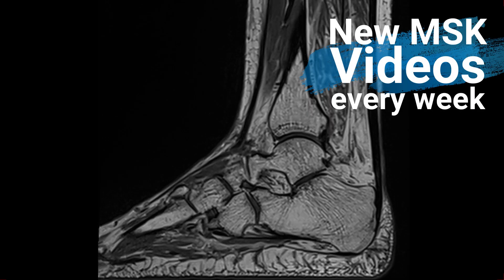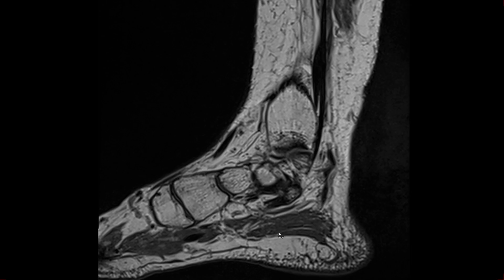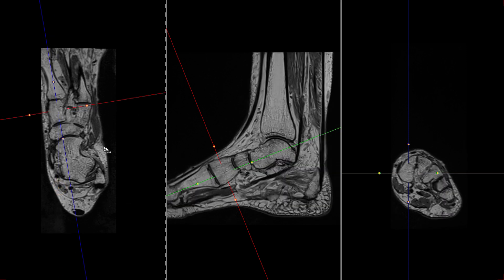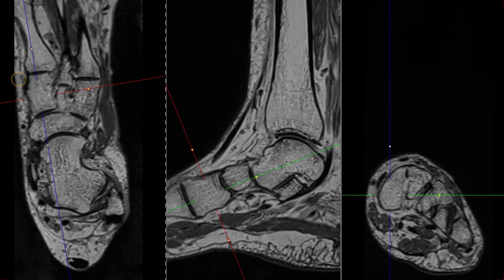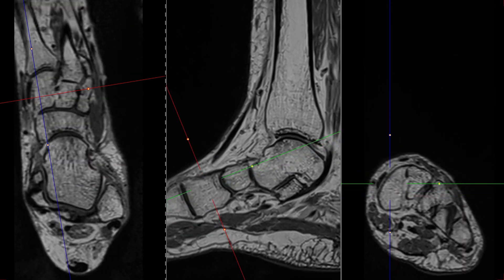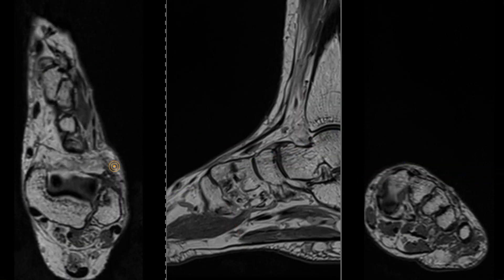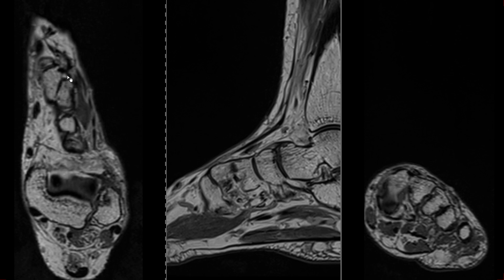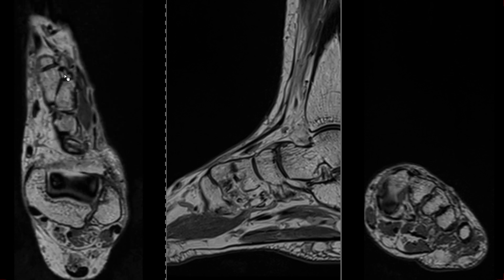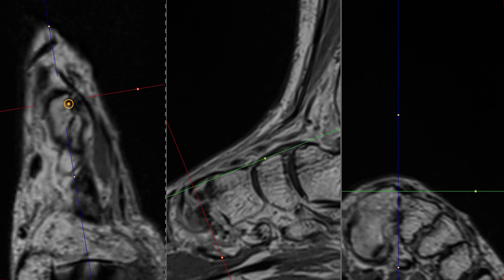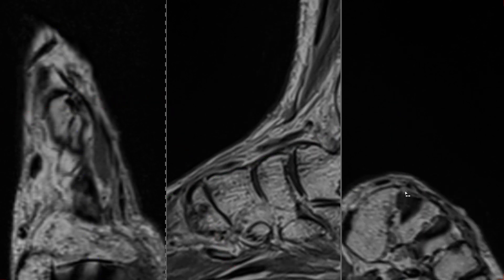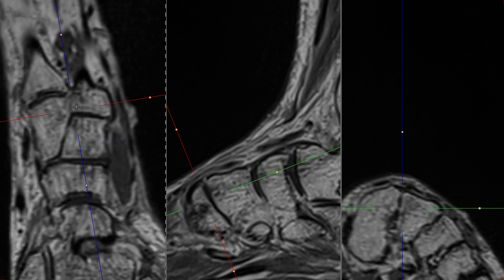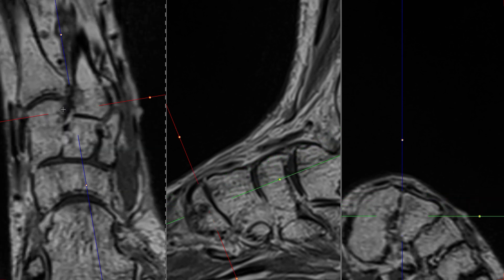Here we have a foot with isotropic voxels that we reformat for better visibility. I am right on the medial cuneiform going to the dorsal aspect of the foot, and we are looking for a ligament that connects to the second metatarsal. You can see a ligament-like structure running onto the base of the second metatarsal — that is the dorsal Lisfranc ligament, which is the weakest of the three.